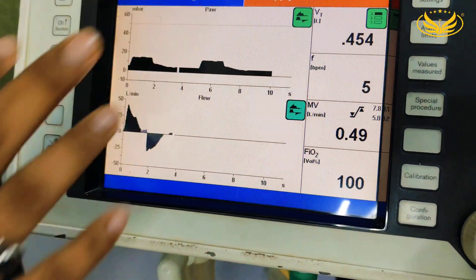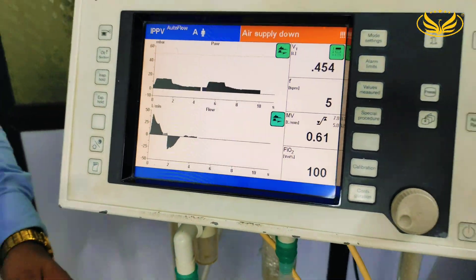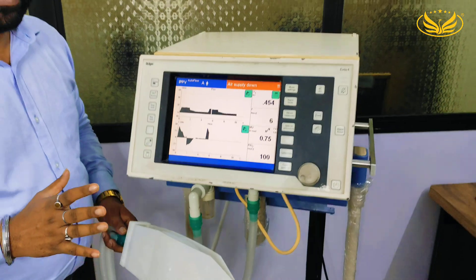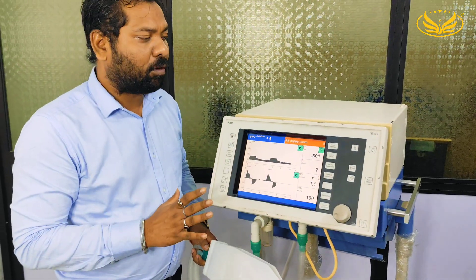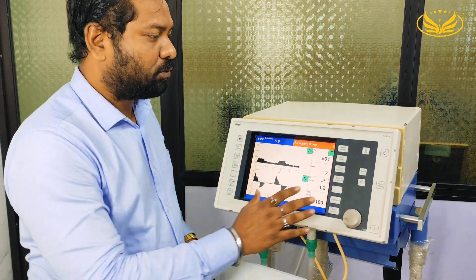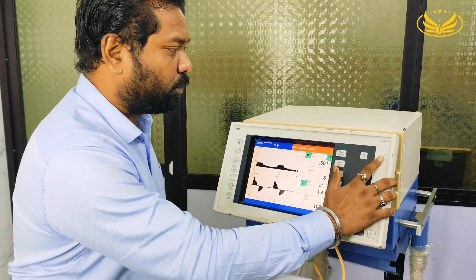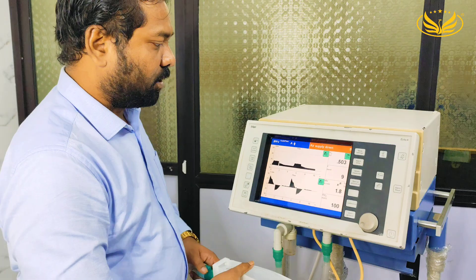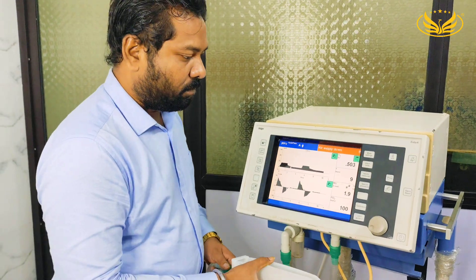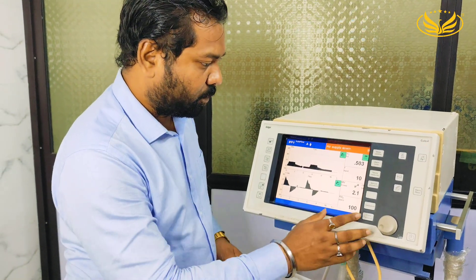Now as I said earlier, we have not attached the compressor, so we have got an alarm of air supply down. What we have to do is silence this alarm using this button.